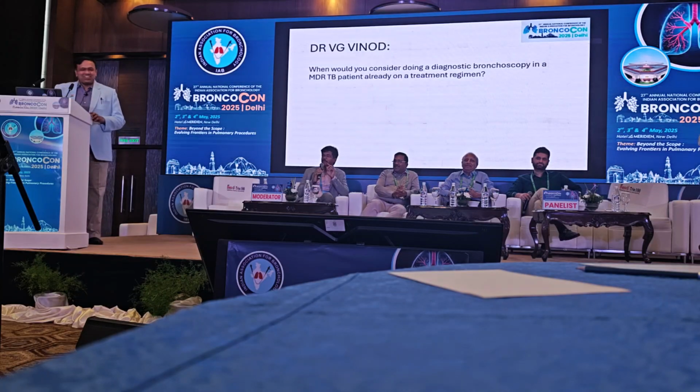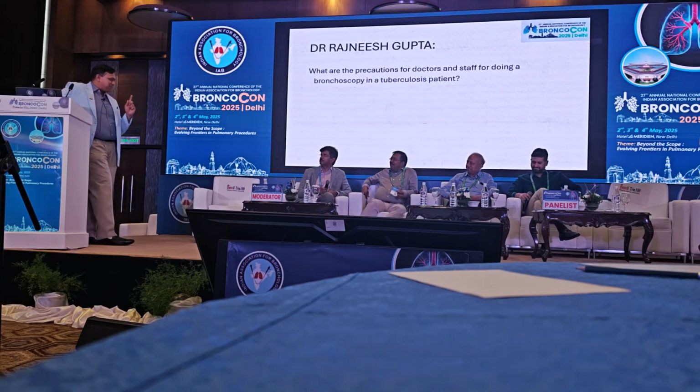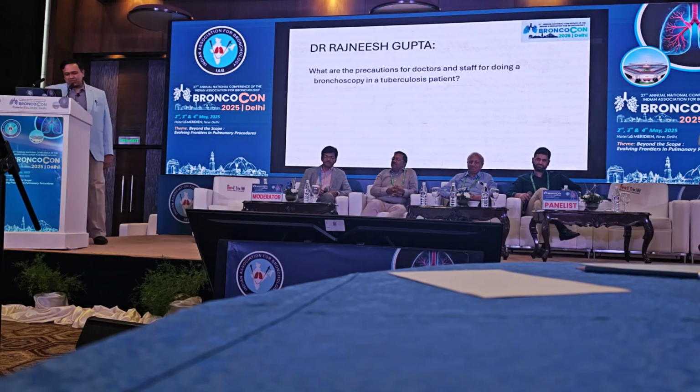One thing I noticed is, till we finish, everyone is concerned. Once the procedure is done, everyone removes the mask and they just roam around the same place. Nice observation, that's true. Remember that the bugs are still there in the same environment. Go out and then remove the mask.